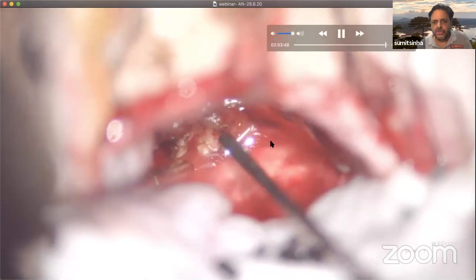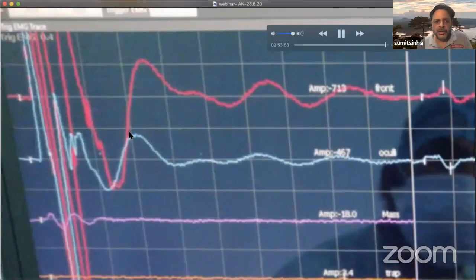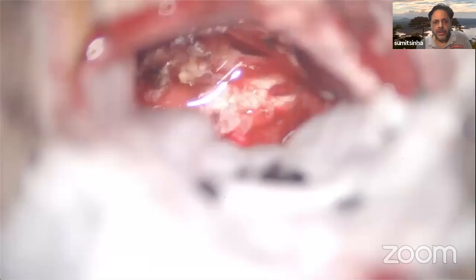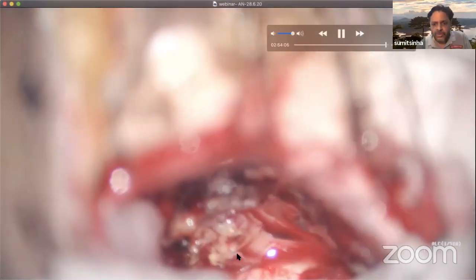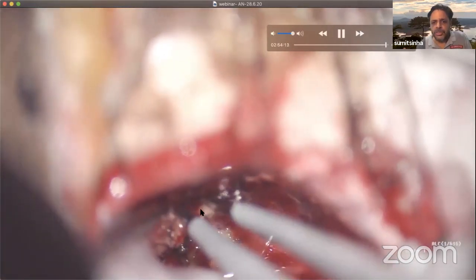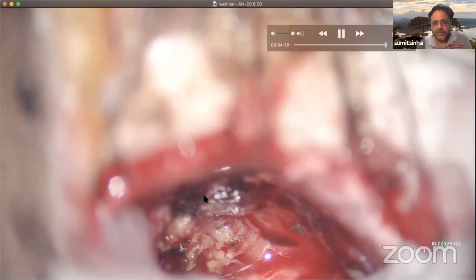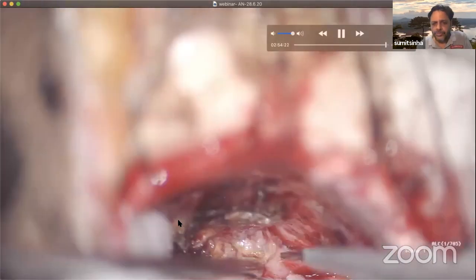The neuromonitoring shows a wonderful nerve potential recorded here, and this means that the nerve is still functioning. So this is a functionally and anatomically preserved facial nerve after the end of the surgery. And here, this is the small portion of the tumor which is still clinging onto the porus, which I am coagulating from the anterior lip of the meatus and attempting to remove.